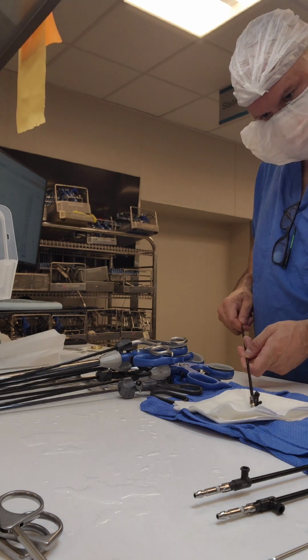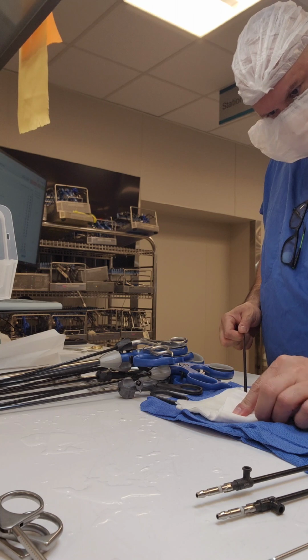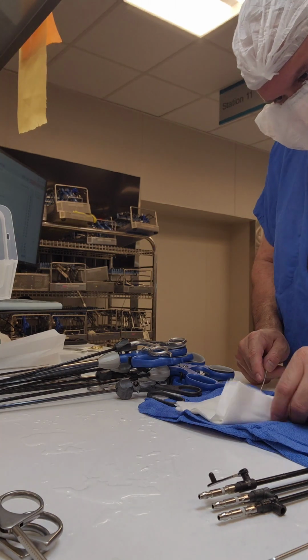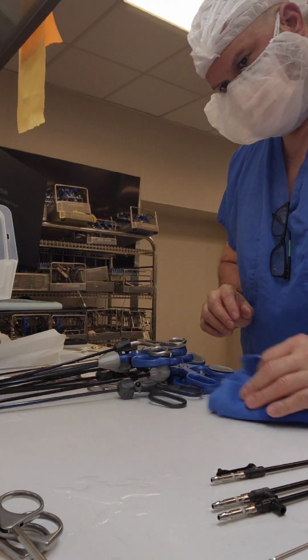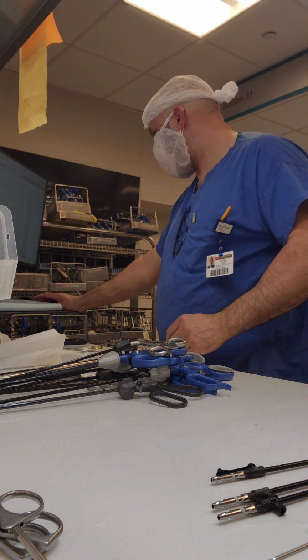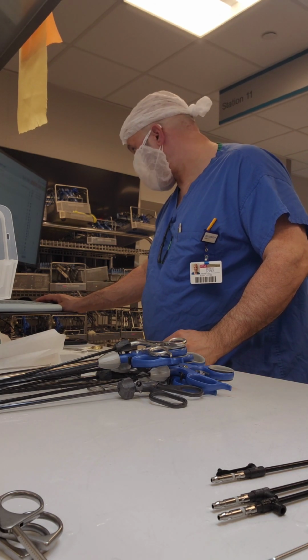As you can see, I'm putting the brush in, and it comes out on the other side. I use a tissue to blot it to see if I get any bioburden or anything out there, and I slowly take it out and blot it again, making sure I see no bioburden, no debris. Okay, once I'm done with that, everything goes in the trash. I dry at my station, and now it's time to start identifying. You see how long it took me to do this inspection?